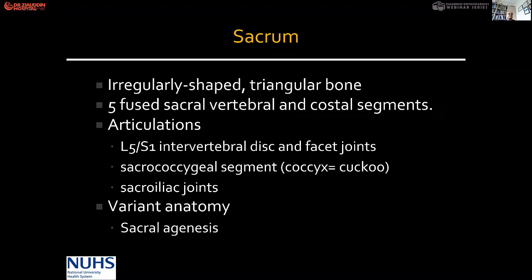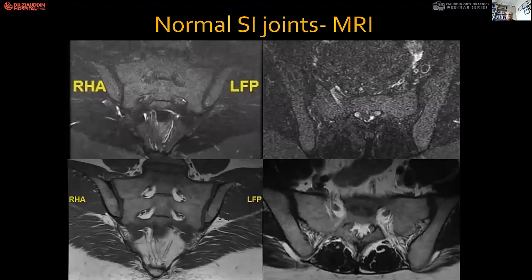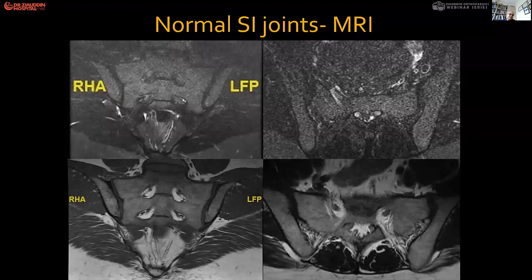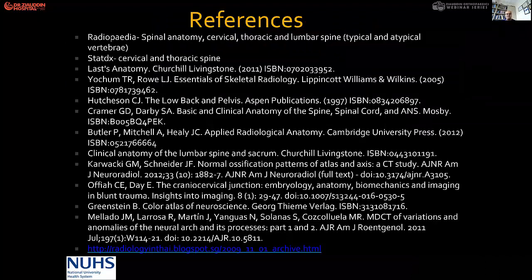A sacrum MRI shows T1-weighted images of the sacroiliac joint on the left pictures, and slightly posterior cuts show the neuroforamina. A contrast-enhancing sequence shows the fat lighting up around the nerve roots. The references for this section are borrowed and adapted from radiology colleagues for orthopedic residents. We'll now have a quick overview of some basic imaging in orthopedics.